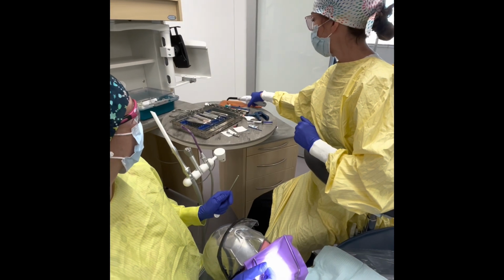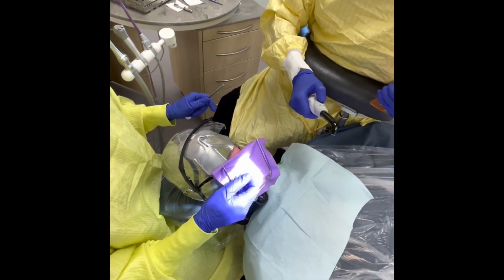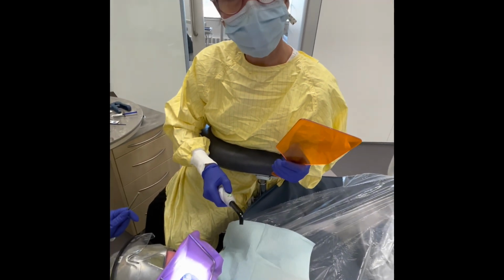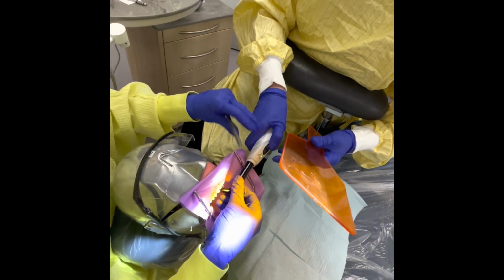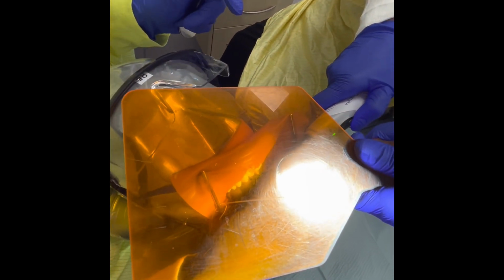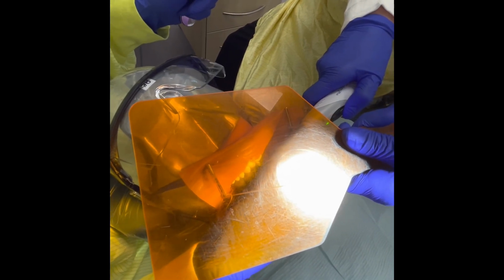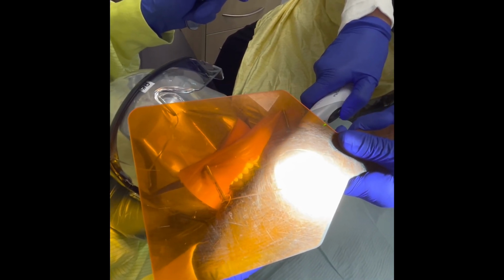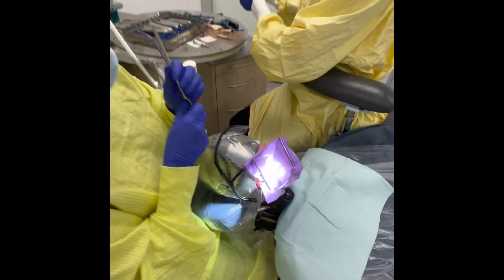So I have my light here. I'm going to bring my paddle over. Again, Amanda is going to ensure that she's guiding me in. I have it set for 10 seconds. So we'll turn the tip up here and I will help guide. And Stacy is going to use the paddle to protect us both so that our eyes are shielded from the curing light. Okay, 10 seconds has passed.